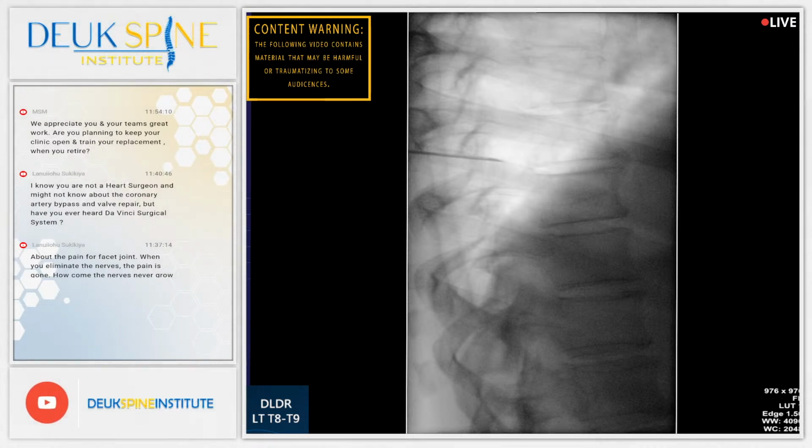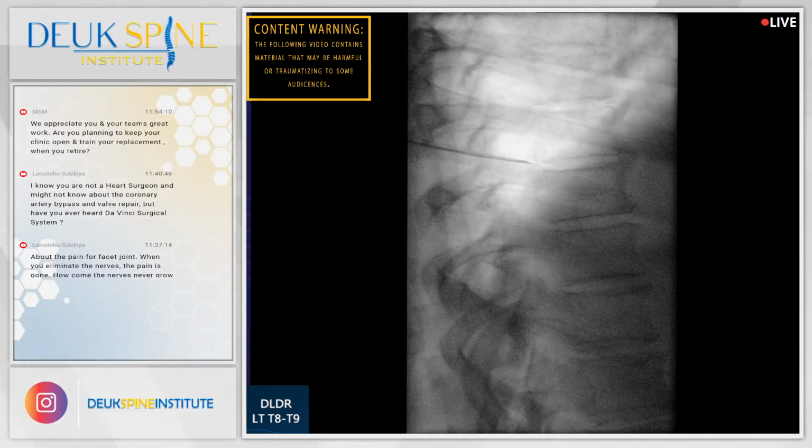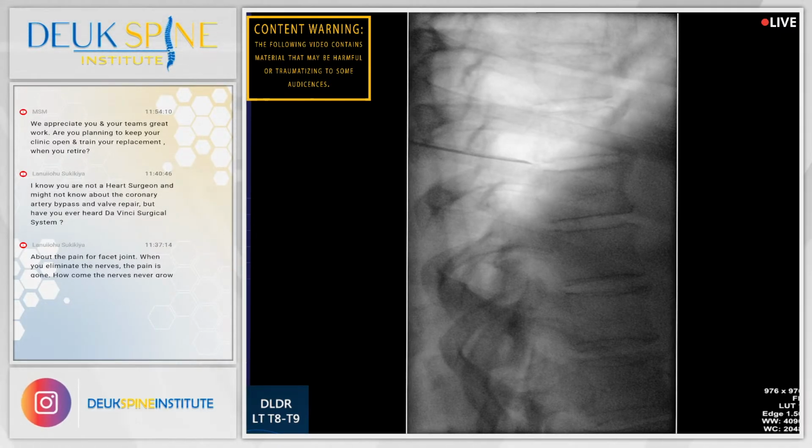That's the lateral? Yes, sir. Well, you know what? It could be. It could very well be that we may be able to make this work. Again, I'm hitting that hard bone. Shot. All right, so we've made some progress. Let's see on the other view. Do one more lateral, and then let's get an AP and see where we are.